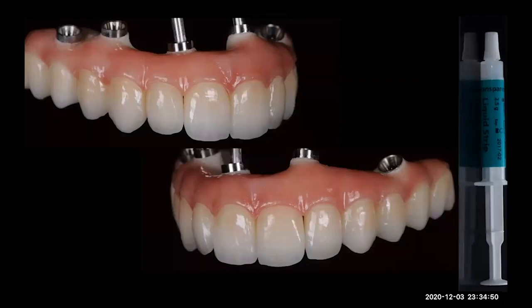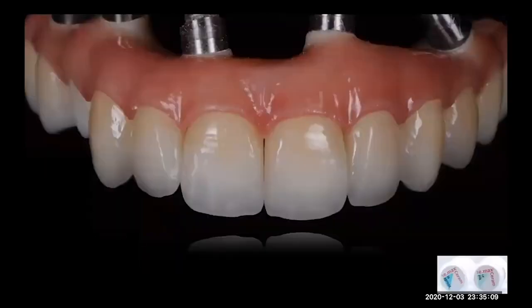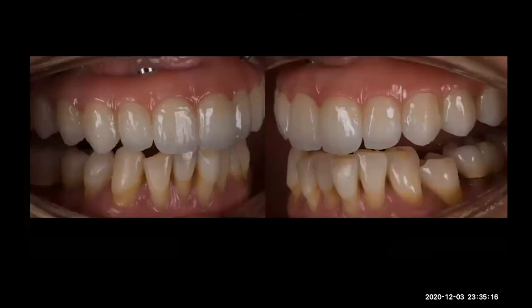We glue the crowns directly to the zirconia, and we use that glycerin liquid around the margins to avoid some discoloration of the cement later on. So you can see the vitality of the restorations with the scoop technique. You can see some movements, some translucency, some crack lines, some different colors in the incisal part. And this is the case in the mouth.